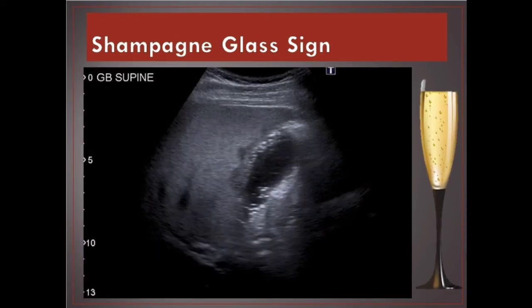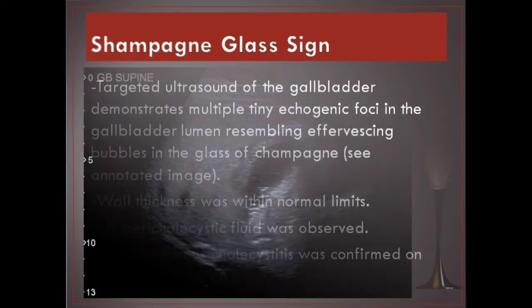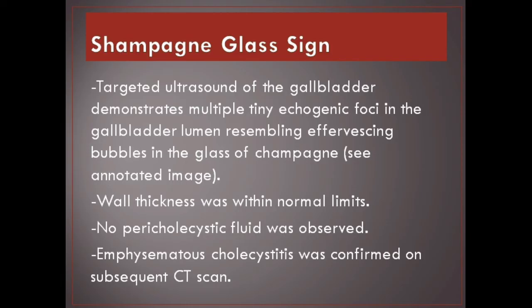Champagne glass sign. Targeted ultrasound of the gallbladder demonstrates multiple tiny echogenic foci in the gallbladder lumen resembling effervescing bubbles in a glass of champagne. Wall thickness was within normal limits and no pericholecystic fluid was observed. Emphysematous cholecystitis was confirmed on subsequent CT scan.